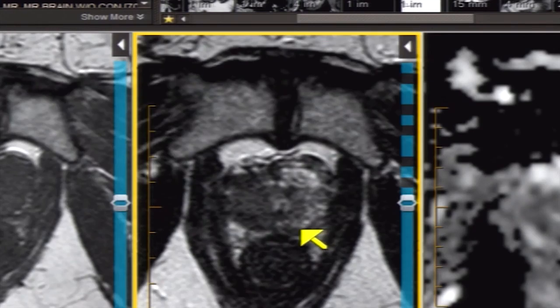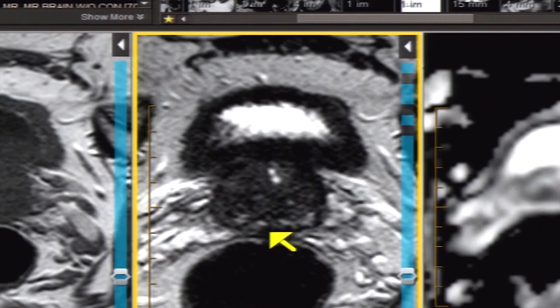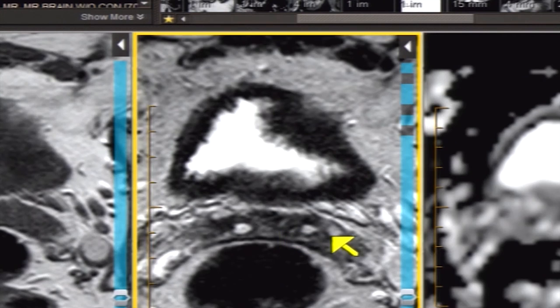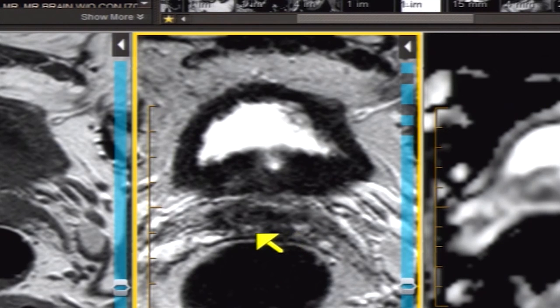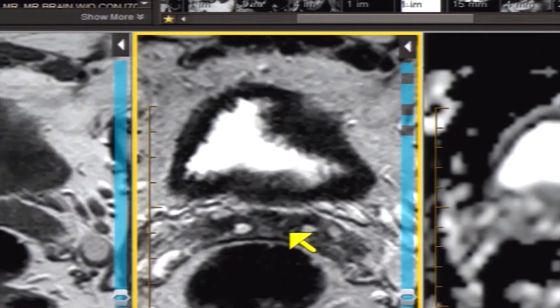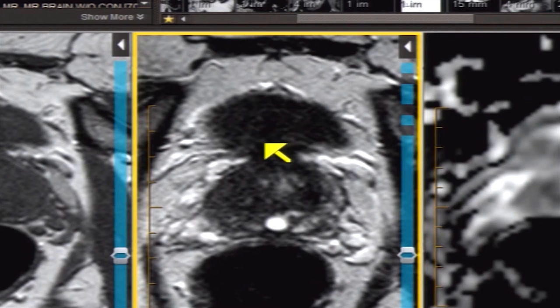There is another stroma which is a little harder to see — this darker area up near the prostate base — known as the muscular stroma. The muscular stroma can usually be found where the seminal vesicles come together. In the coronal projection it looks like an inverted V, but in the axial projection a common mistake is to confuse this muscular stroma with intermediate signal intensity cancer.